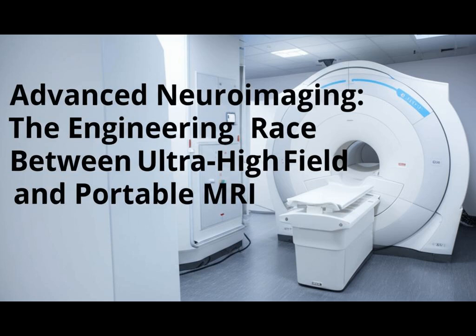Now, let's pivot to the other end of the spectrum, portable MRI. Here, the focus shifts from ultimate detail to accessibility and point-of-care use. These systems typically use much lower magnetic fields, sometimes below 0.1 Tesla. The engineering challenge here is getting useful images despite the lower signal. Key innovations include using permanent magnets, which cuts down drastically on size, cost, and the need for complex cooling. Engineers optimize these compact designs, and crucially, advanced software and artificial intelligence play a huge role. AI helps reconstruct images, reduce noise, and enhance quality from the low-field data.